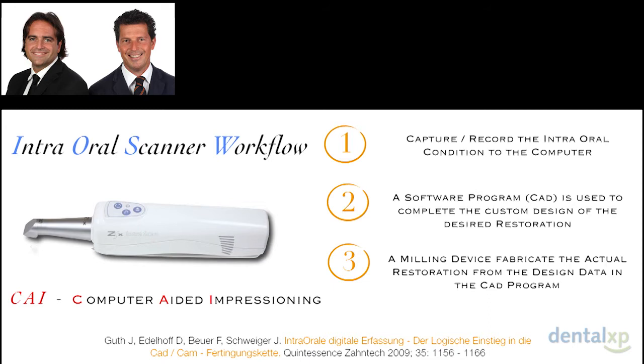The first part is something that is going to change, and has already changed, the clinical workflow. We saw with Alessandro that the technical workflow has already been changed by this revolution. But what about the clinical standpoint? What are the advantages that we as clinicians have and can achieve with these new instruments? And without forgetting that these instruments may also help our patient comfort, increasing their quality of life also during the treatment plan, not only at the end of the treatment plan process.